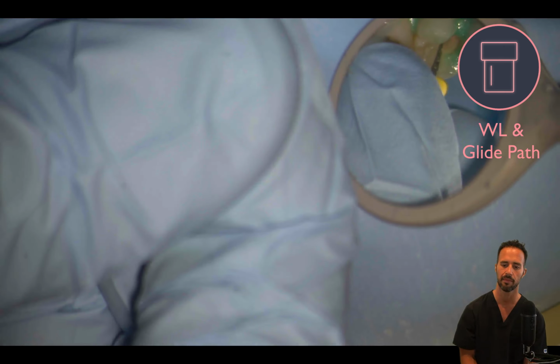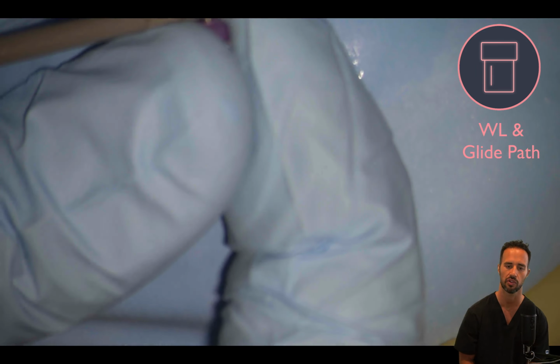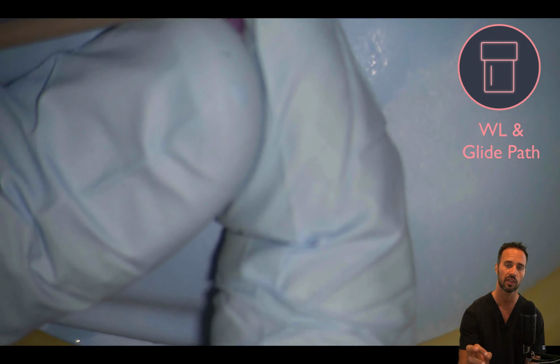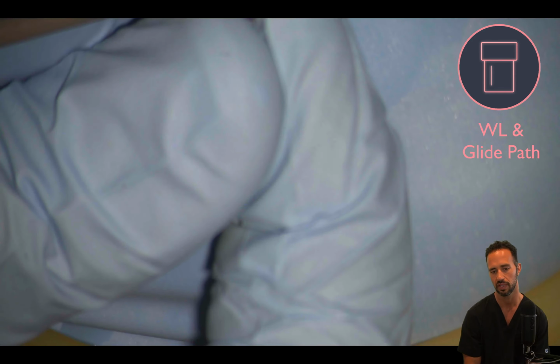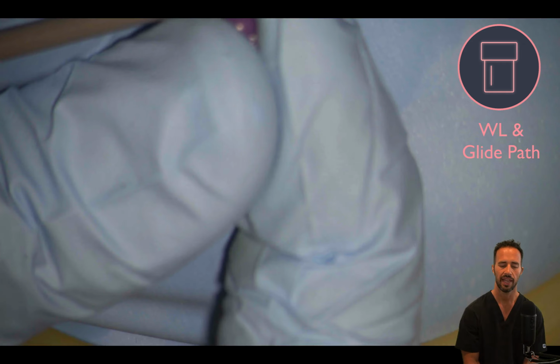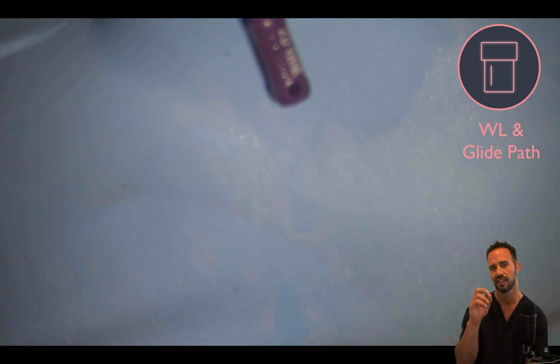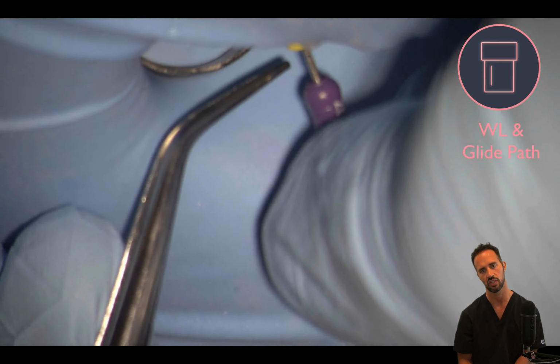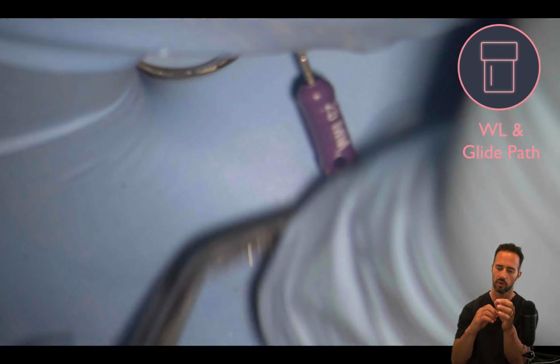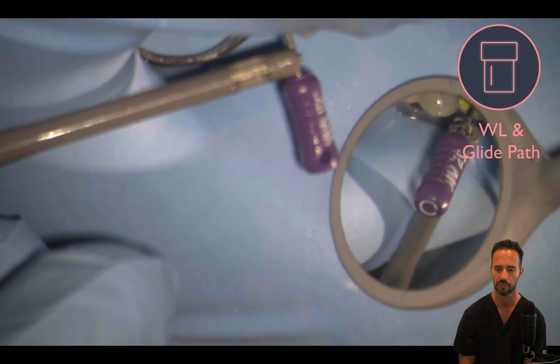And now we're going ahead and moving on to the palatal canal and doing that same thing with the 10 file. Okay, getting to length and obtaining a measurement. Both the buccal and the palatal canals are found in this case to be 18.5 millimeters. Okay, and you want to just take your time and make sure that you have a nice stable reading on your apex locator, right to that point that I mentioned between the number 1 and where it says apex. Okay, that's going to be a great endpoint for you.